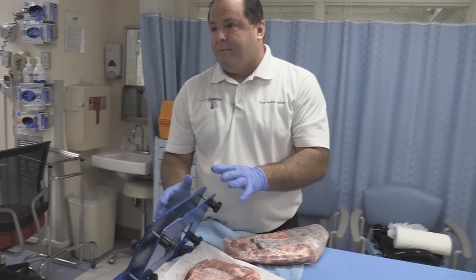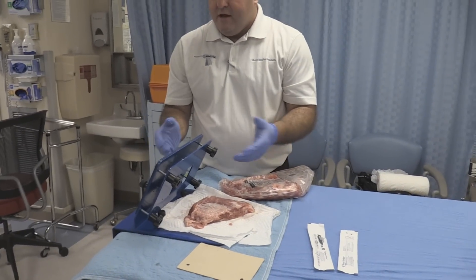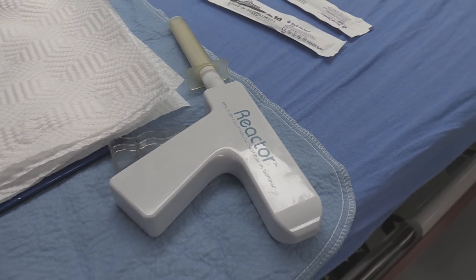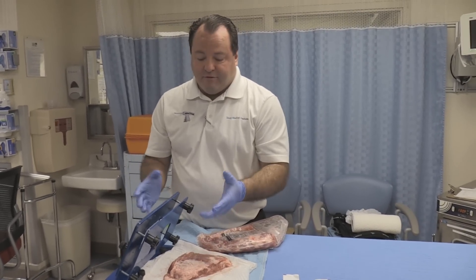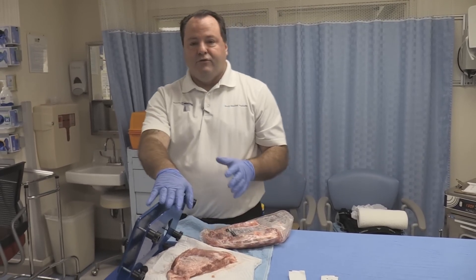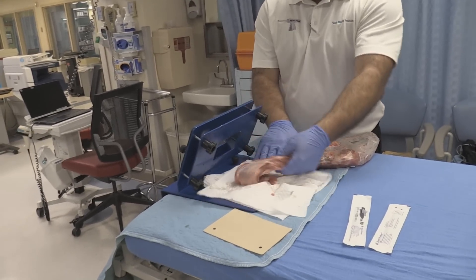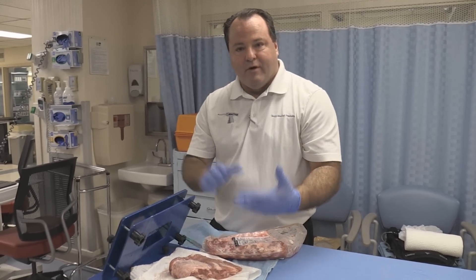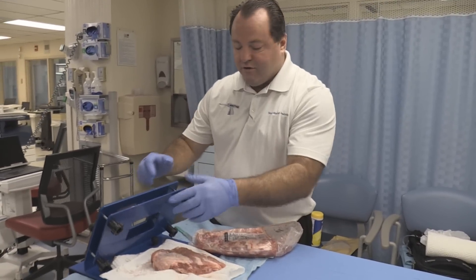This is the T3 from Sharp Medical Products. It's a rib demonstration model for chest tube insertion. You can use it with our product called the Reactor, which is a chest tube insertion device, or you can demonstrate traditional open chest tube insertion. We want to show how we set it up. You want St. Louis style ribs — they're flatter and slide in easier — then insert and secure them in place.